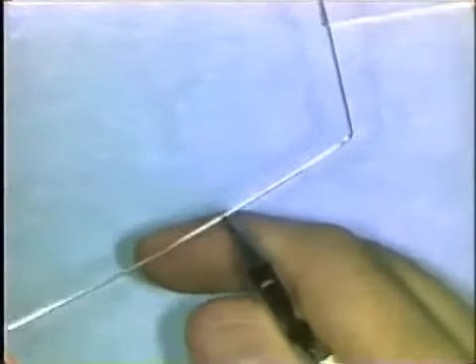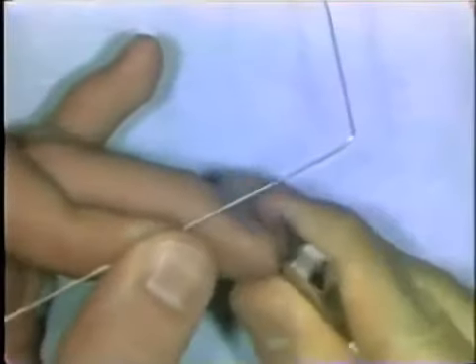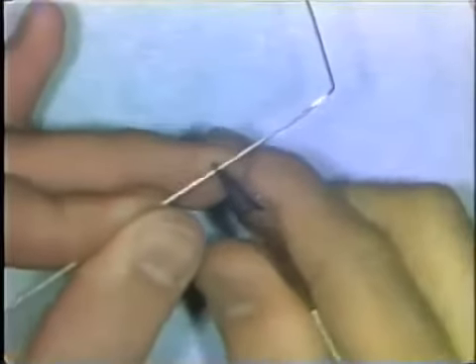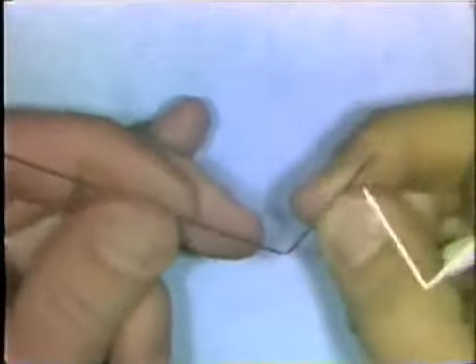Thirdly, don't bend the wire over the round beak or the square beak of the 139 pliers. If you do, it's possible to create a small surface defect in the wire — a nick in the wire that may bring about breakage later on.